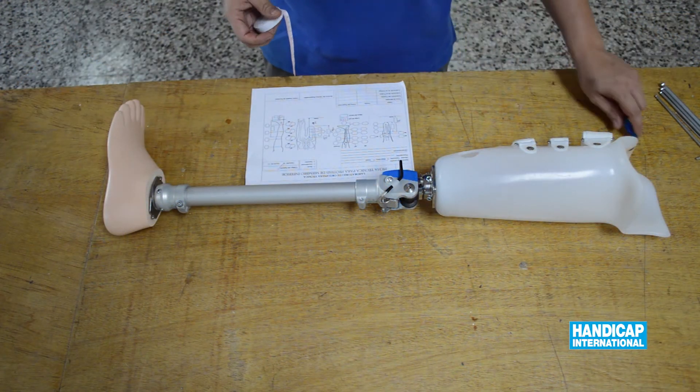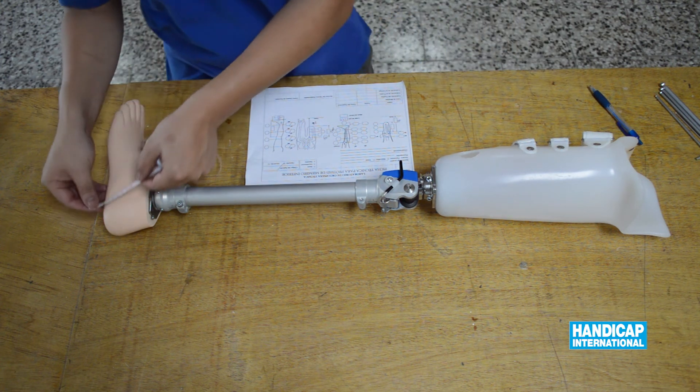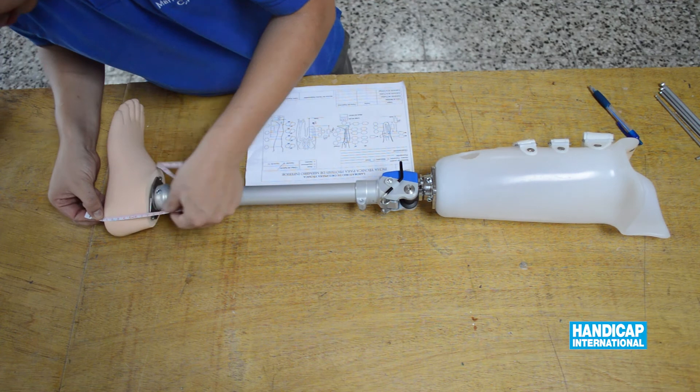Take a measurement from the ischium to the floor and subtract the length from the knee to the floor you had taken before.